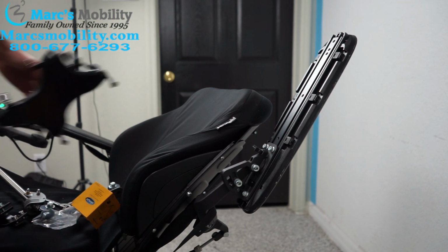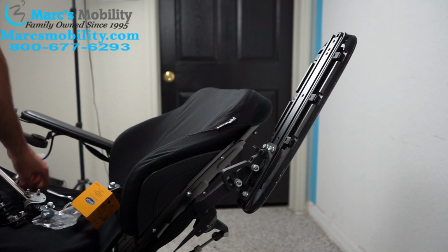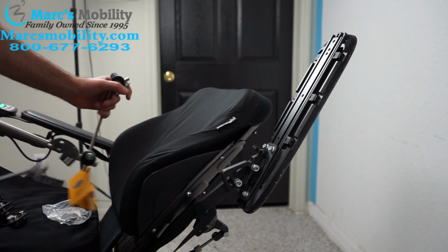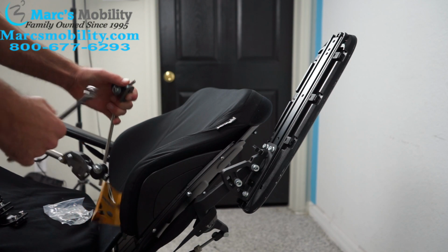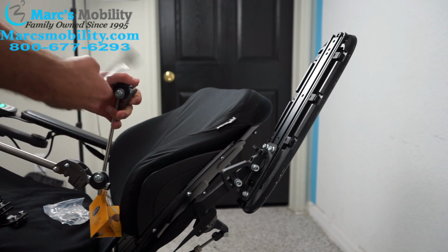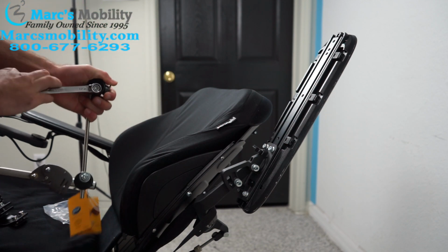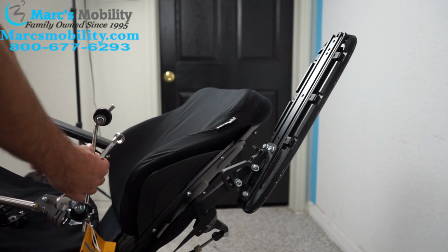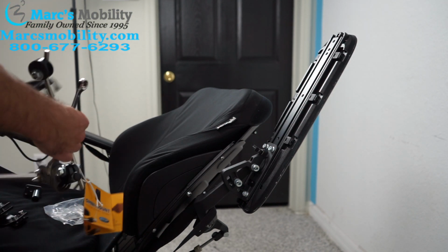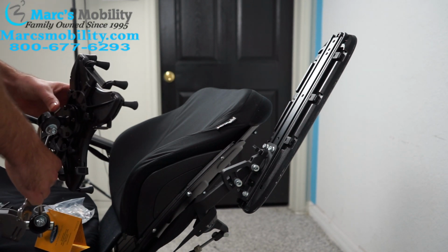And I've also got my tablet holder that I'm going to install. So for the tablet holder in specific, I actually need to remove this piece right here, because the tablet holder is going to go in there. So I'm going to start with a 1/2 inch wrench and loosen that, and it should pop right out. That way, later I can install the tablet holder through there and then tighten it.